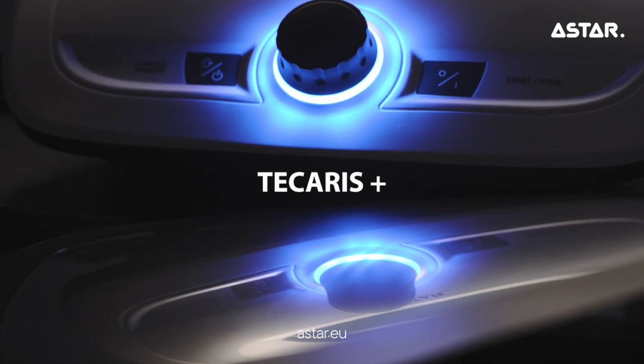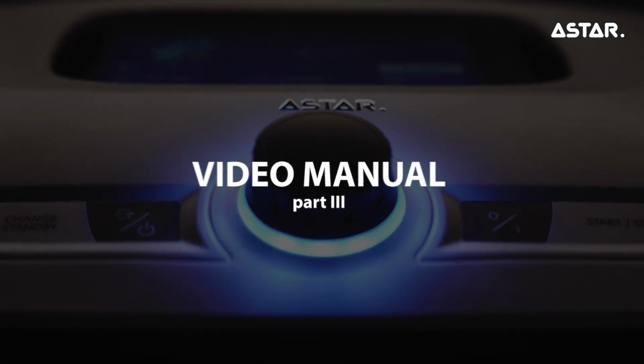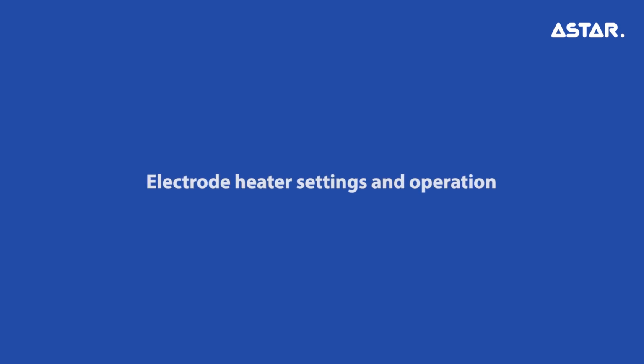Tecaris Plus. Video manual. Electrode heater settings and operation.